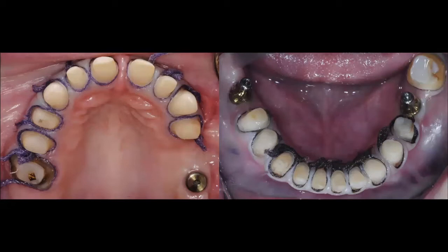So now you have a yttrium 3 mole type of zirconia restoration for your posterior teeth that is more opaque, but at the same time stronger, so it will better resist the occlusal forces or function.